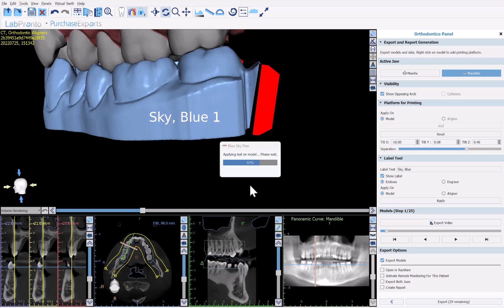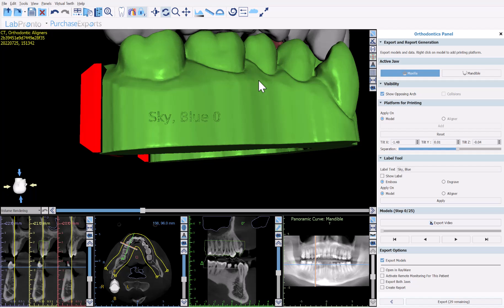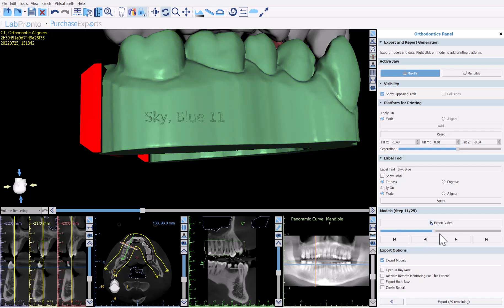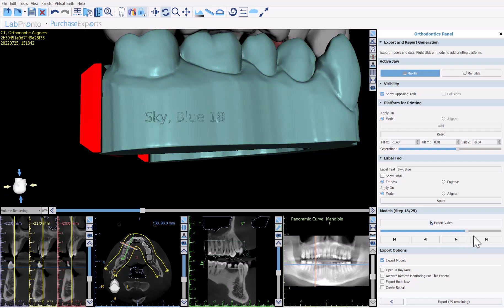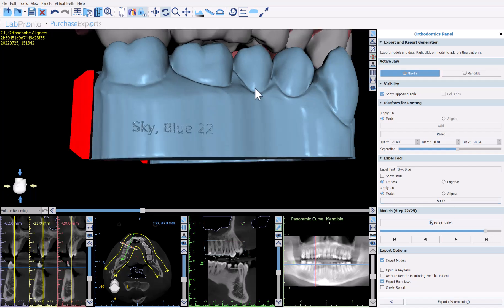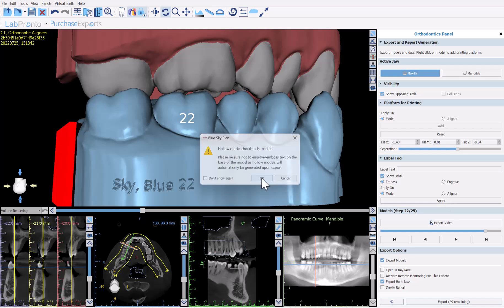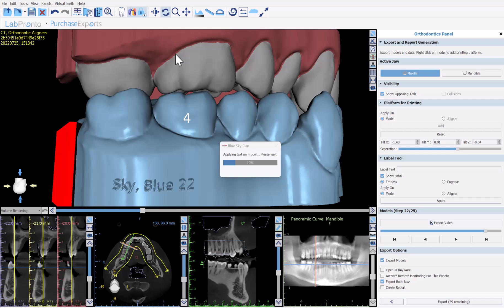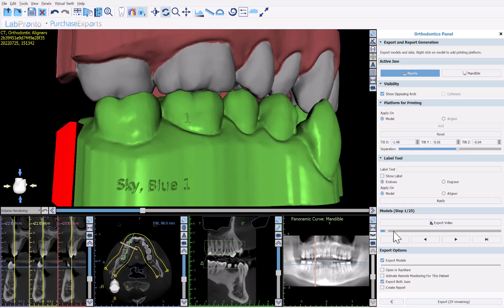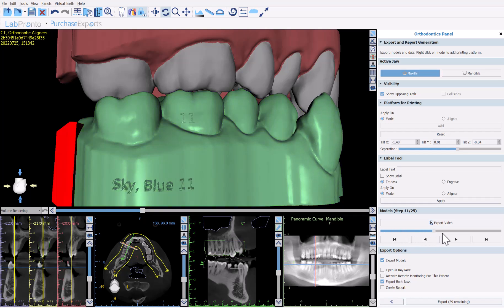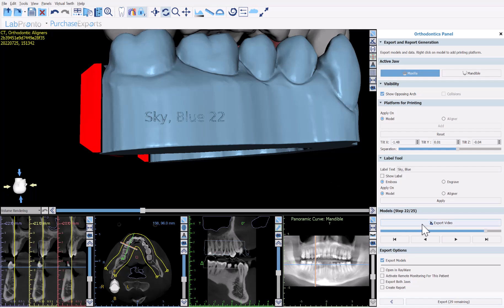The software applies the text to all relevant models. Sliding through the model steps, we can see the text applied to each model with the correct numbering. Multiple labels can be applied to the same models. To add numbering onto the aligner itself, remove the label text, click show label, position it, and click apply. The numbering is applied to all relevant models accordingly.